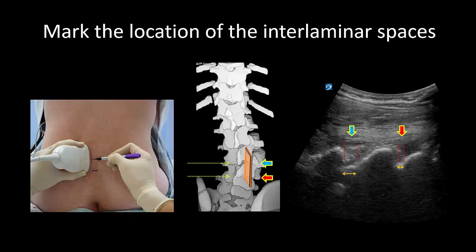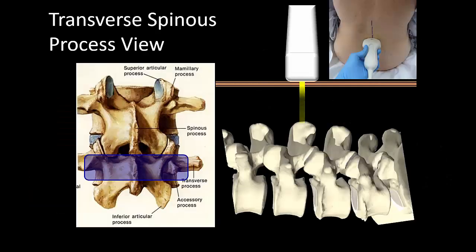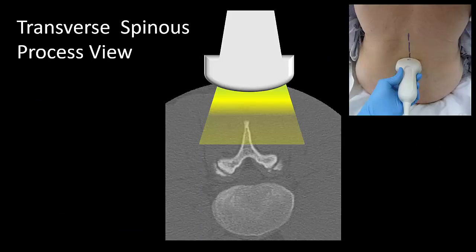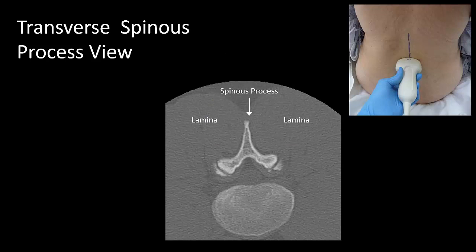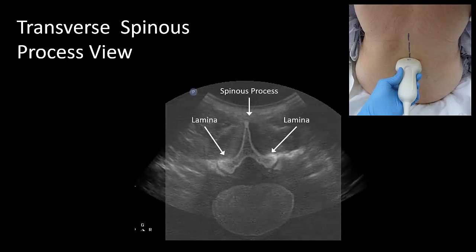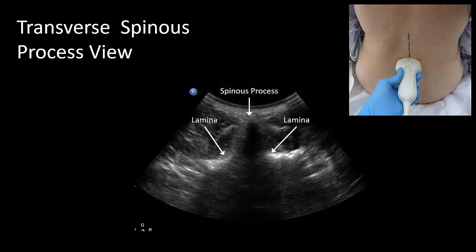Having identified and assessed the interlaminar spaces in the parasagittal oblique view, the location of these spaces is marked on the skin. The next step is to turn the probe into a transverse orientation, where one of two views is obtained. The first is a spinous process view, where the bony spinous process and lamina produce a characteristic acoustic shadow that looks a little bit like a church steeple, with a hyperechoic reflection at the tip of the spinous process.